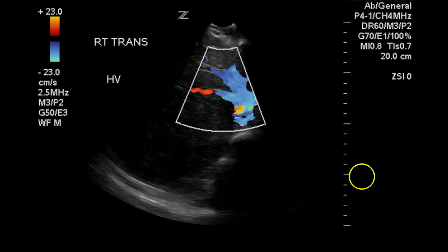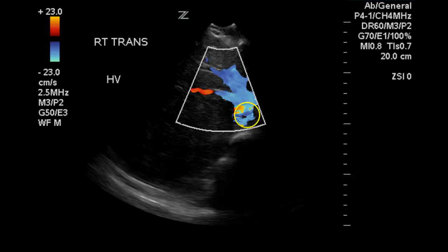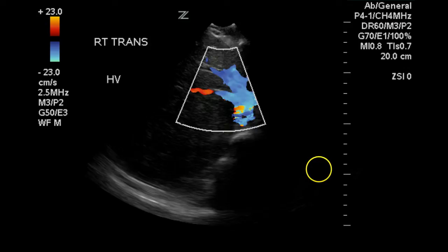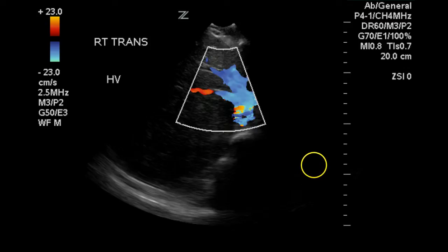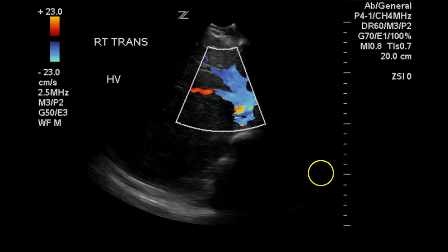This is a normal direction, although a small amount of reverse flow in the central portions of the hepatic veins is normal due to the atrial kick.